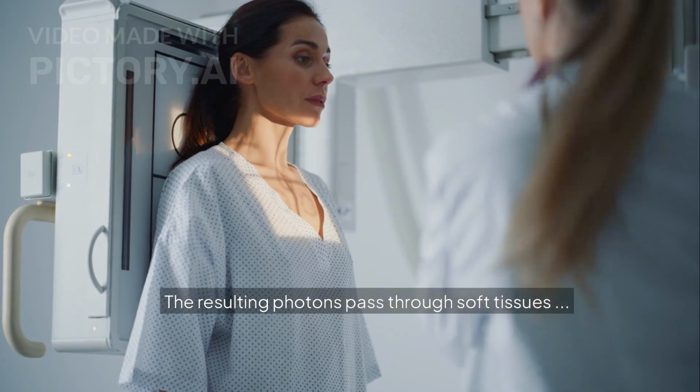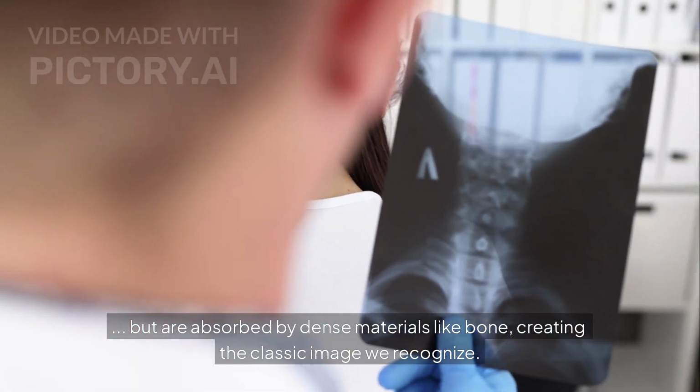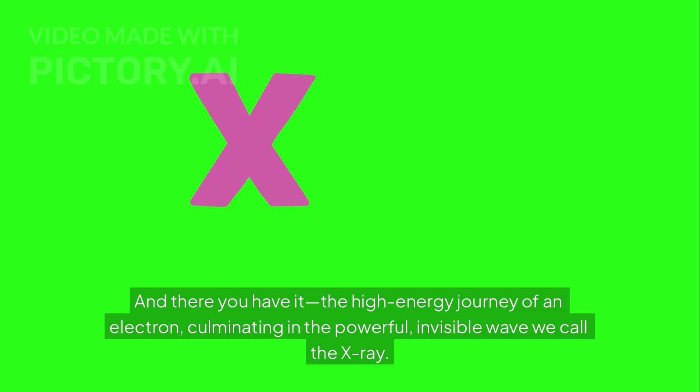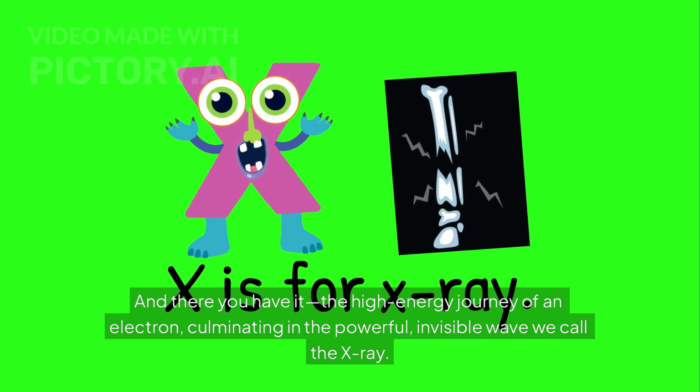The resulting photons pass through soft tissues, but are absorbed by dense materials like bone, creating the classic image we recognize. And there you have it, the high-energy journey of an electron, culminating in the powerful, invisible wave we call the X-ray.